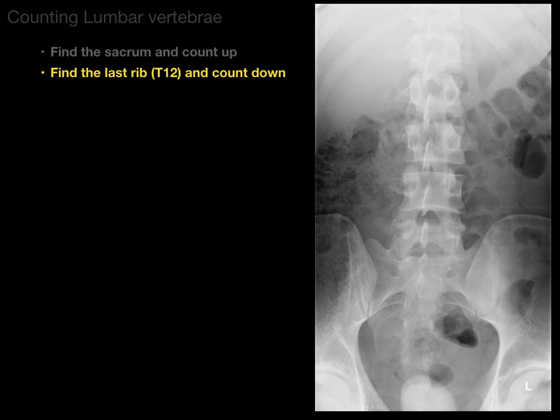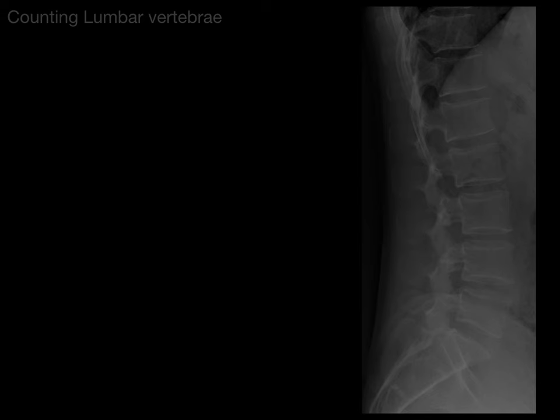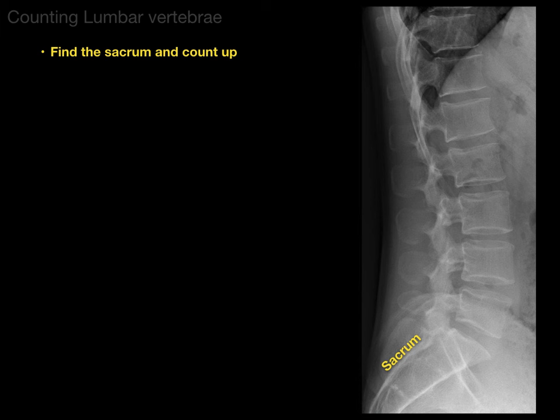The next method is to find the last rib at T12 and count down. There's that last rib — if that's the last rib, that's T12, which makes that L1, L2, L3, L4, L5, and then there's the top of the sacrum and the S1 sacral vertebra. In a lateral view, you can find the sacrum and count up as well. There's our sacrum, S1 sacral vertebra, L5, L4, L3, L2, L1, and then T12.